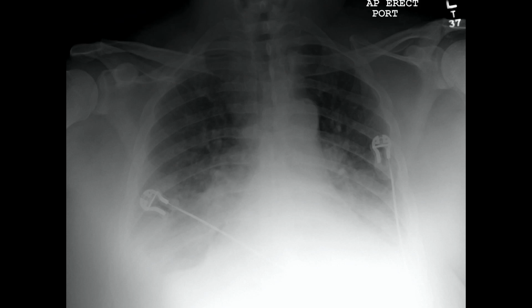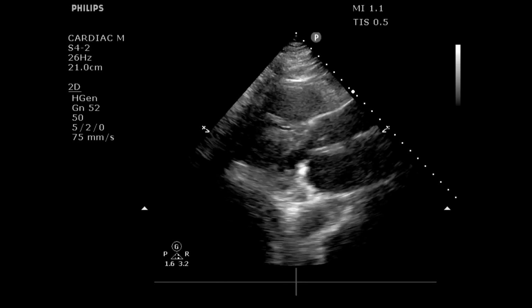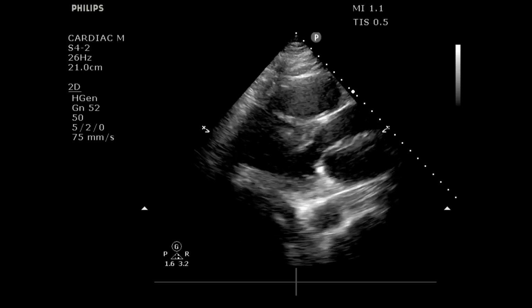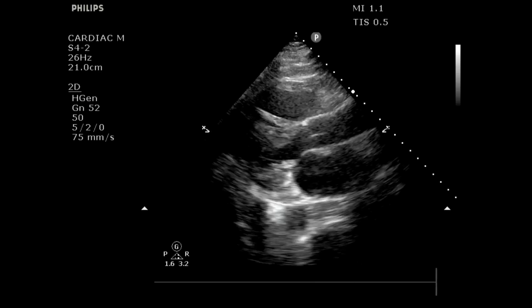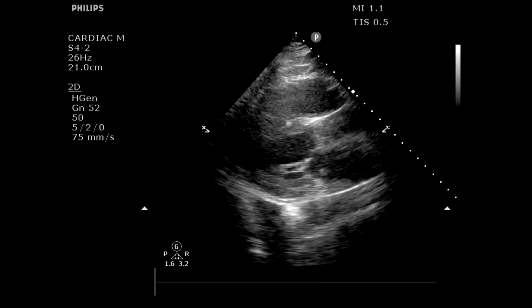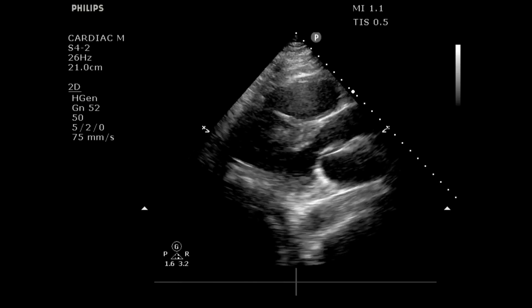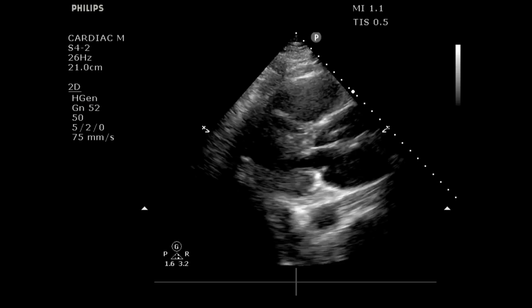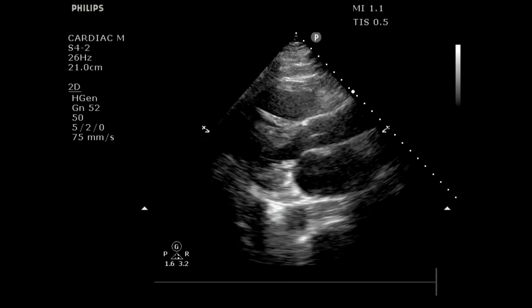So throw in some ultrasound, see what we can find, right? So here's the patient's parasternal long axis window. As we look at this, we can run down our E's. So is there an effusion, yes or no? No, I don't see one, right? What's their ejection fraction look like? Honestly, it looks half decent, right? You can see that anterior leaflet of the mitral valve opening and almost touching that septum, right? You can see that the ventricle squeezes pretty well. So I'm going to say it's a pretty normal ejection fraction, right? Really not a great window to measure equality.